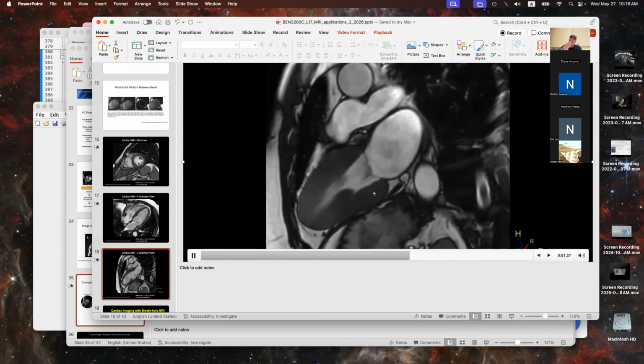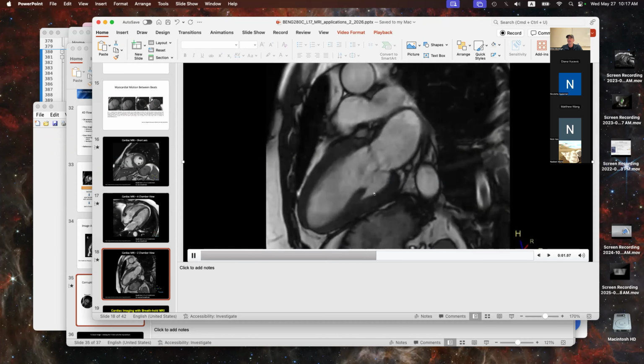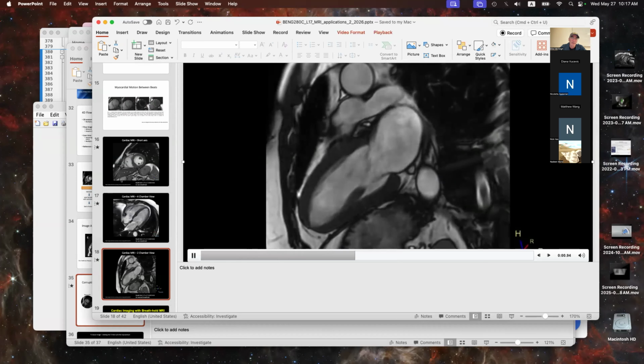So if I say, oh, I'll do my analysis here, tissue is moving through that point. So this is the through plane problem of measuring things in MRI, because all these images are beautiful, but they're all 2D, right? So we're not doing that through plane thing very well.